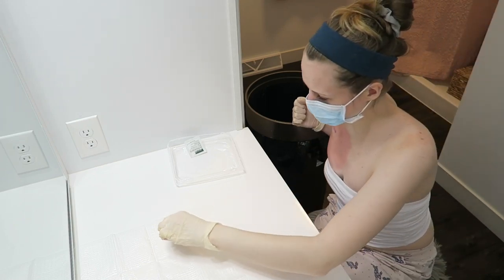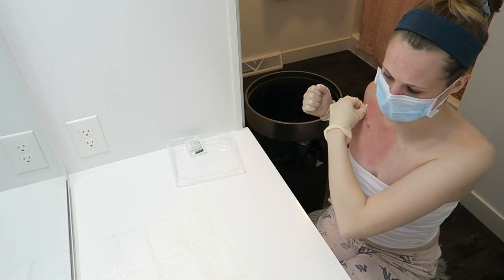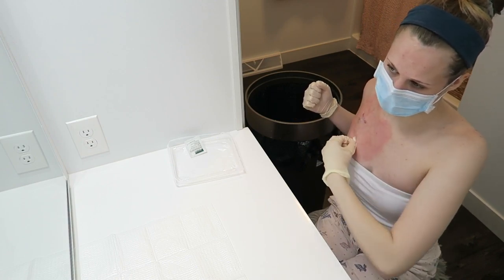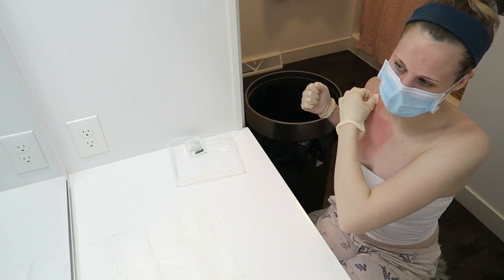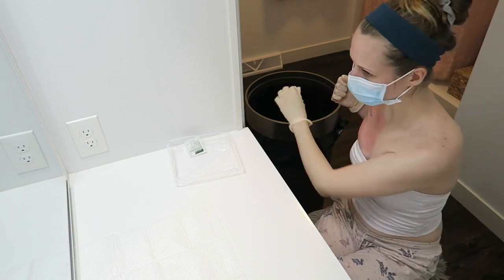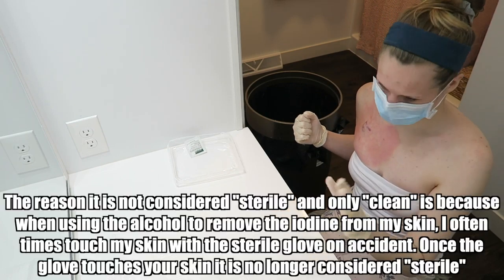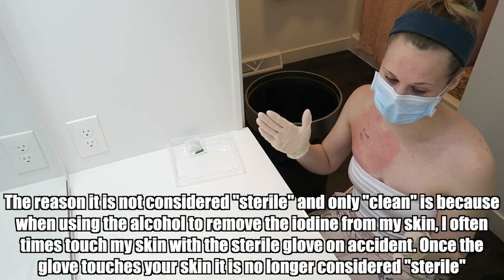All right, the betadine is basically off. I'm gonna do it one more time with this small one. And then just to be safe, I'm actually going to go ahead and change my sterile gloves just because I have been touching things with this left one. Technically, this hand isn't super sterile anymore. This one is completely sterile.